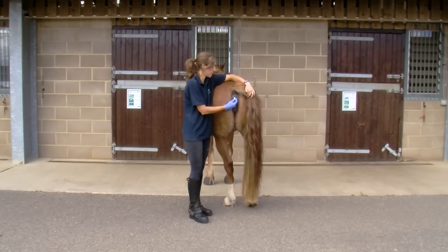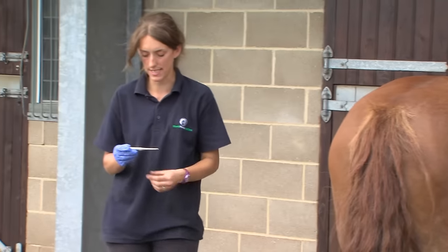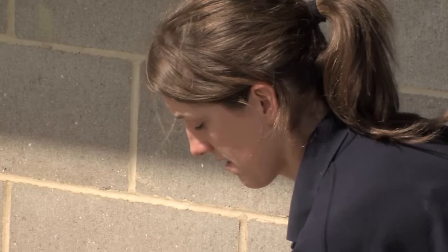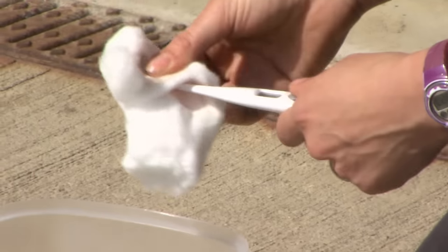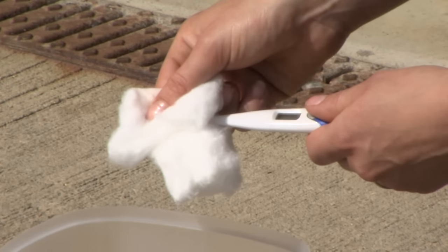I'm now going to take the thermometer out using the same twisting motion that I did when I put it in. I'm going to take a step away from Honey, read the thermometer, and note down my findings. At this point I'm going to clean my thermometer using an antibacterial swab, and if you're using a mercury thermometer, it's a really good time to shake it back down to a number well below the reading you've been given.